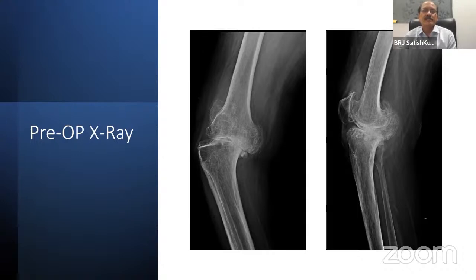As I said, you can see these margins. The lateral margin is this much, and this suggests that there will be lateral stretching. And as I said, you have to take a little bit less of maybe distal femur cut and proximal tibial cut, 2 mm less we have to take. You do a medial release, remove all the osteophytes, do a medial release, then take 2 mm less cut, 2 mm less cut. Now go for a spacer and see what is the gap balance.